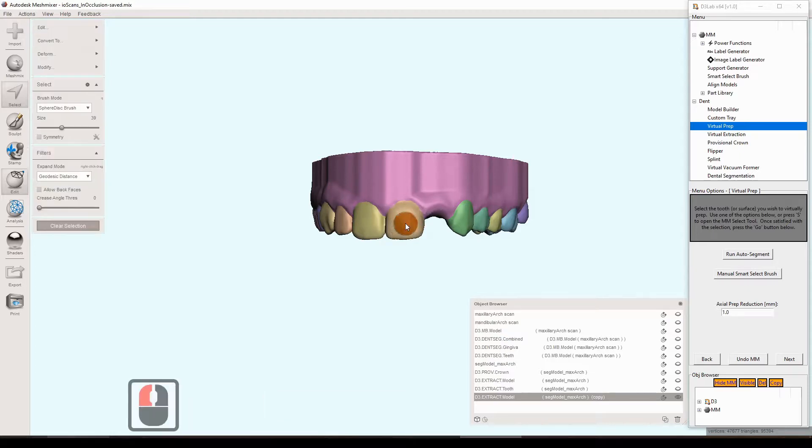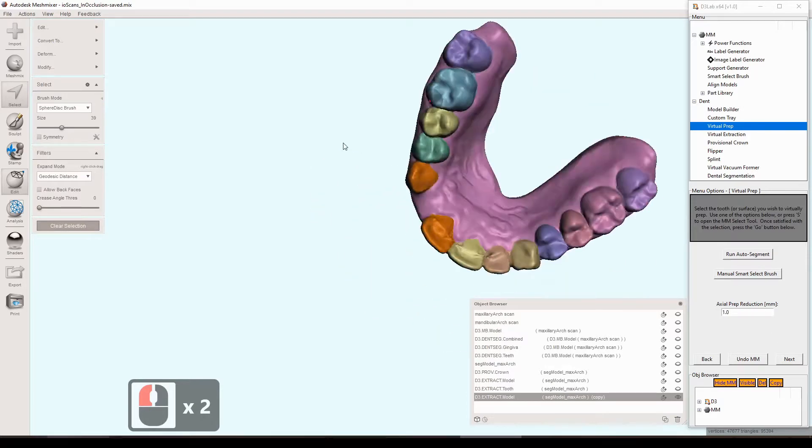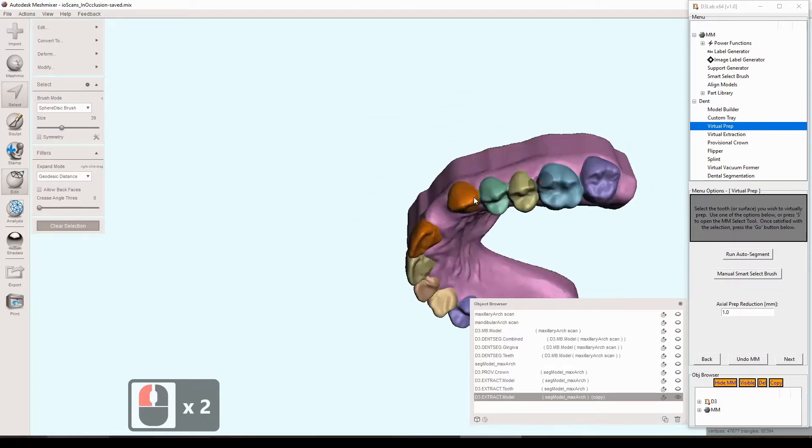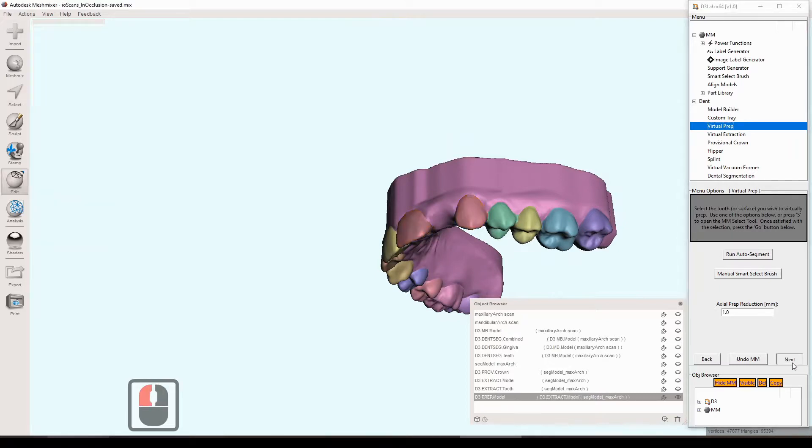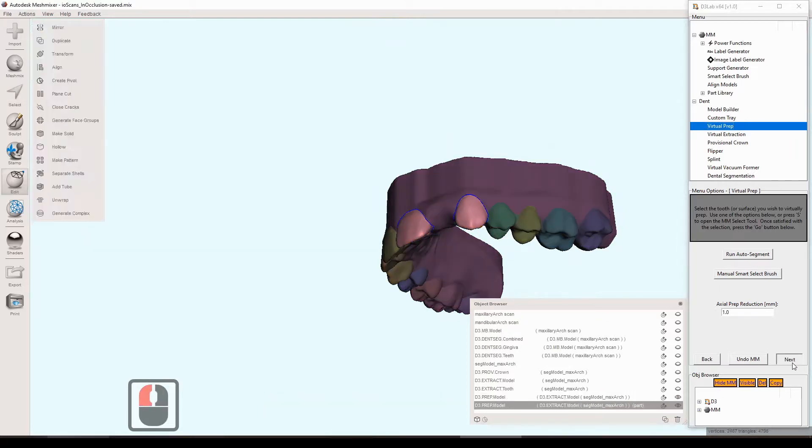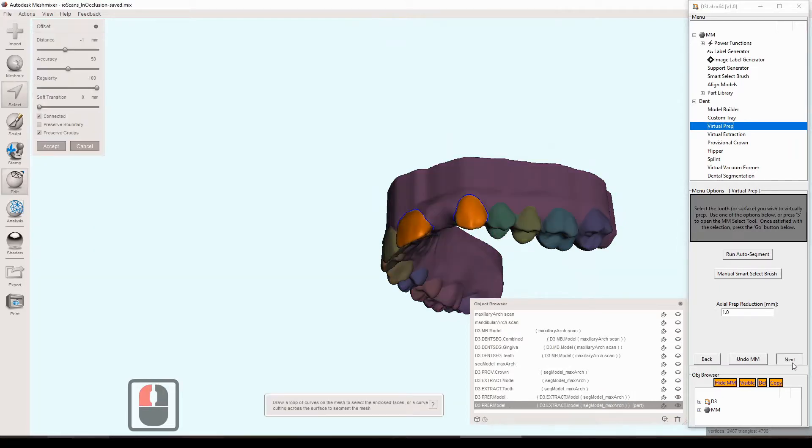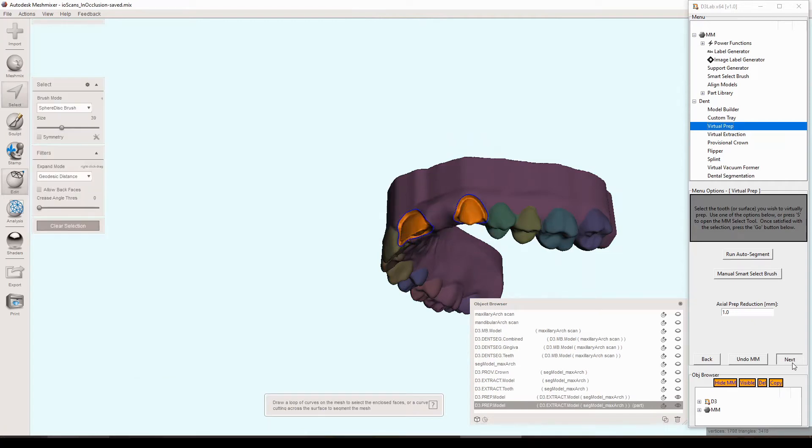And same thing as the other tools. We just need to select the teeth. In this case, we're just going to select the teeth that are adjacent to the extraction site. Quick check looks good. You can pick the axial prep reduction in millimeters. Default is one millimeter. It goes through some steps here.